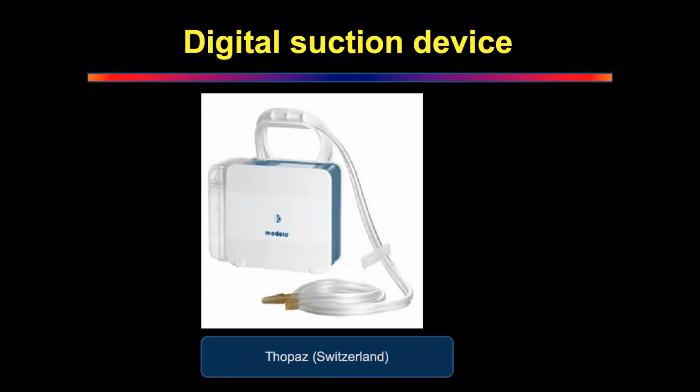It actually gives you a graph of exactly whether there was an air leak or no air leak, and the period at which that air leak has stopped. Do you understand that? Is it clear? So this is a very, very good device. It's excellent for continuous, sustained suction. If you are giving -2 kilopascals, it actually gives -2 kilopascals as opposed to the wall suction, which could be irregular.